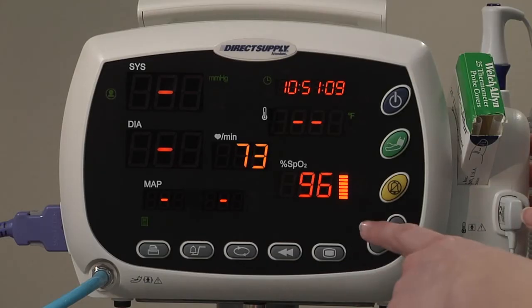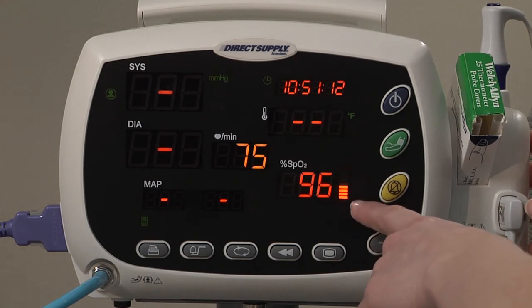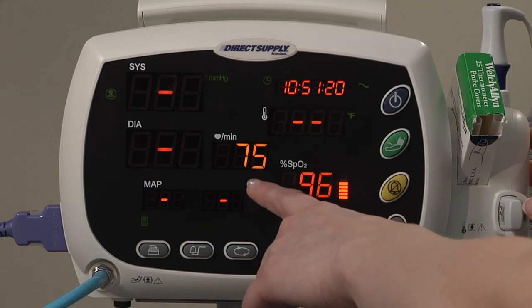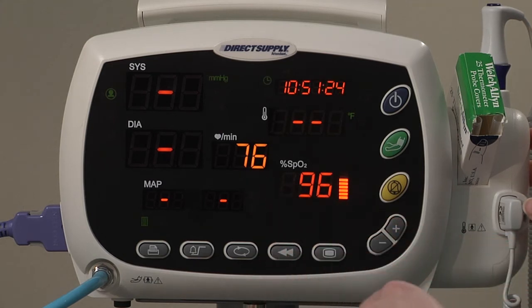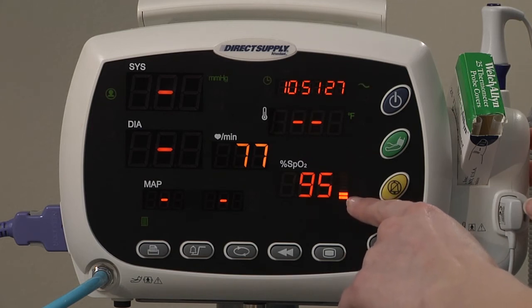Once the finger sensor is applied, the unit will automatically take the measurements. While this is happening, the pulse amplitude indicator will rise and fall in rhythm with the monitored pulse rate on the display, showing the relative strength of the detected pulse. As the detected pulse becomes stronger, more bars will light.